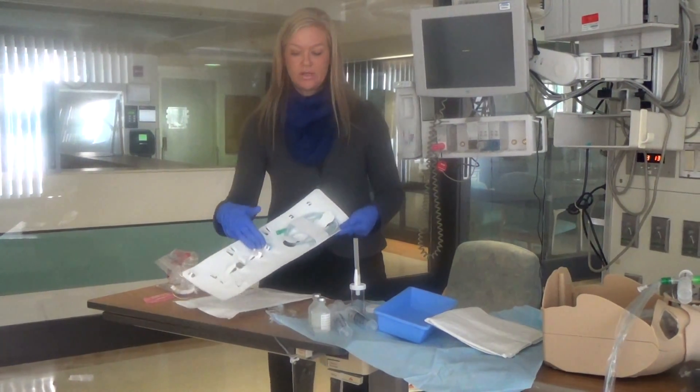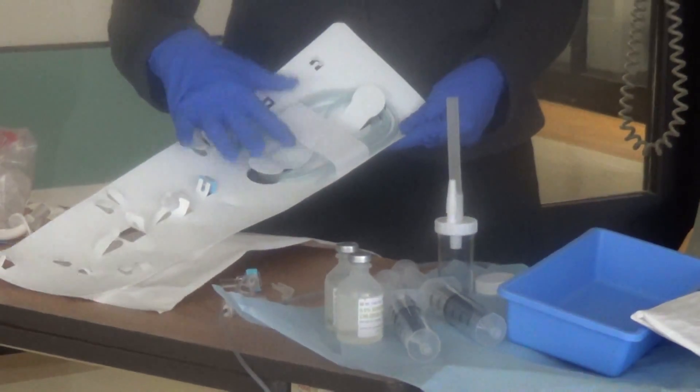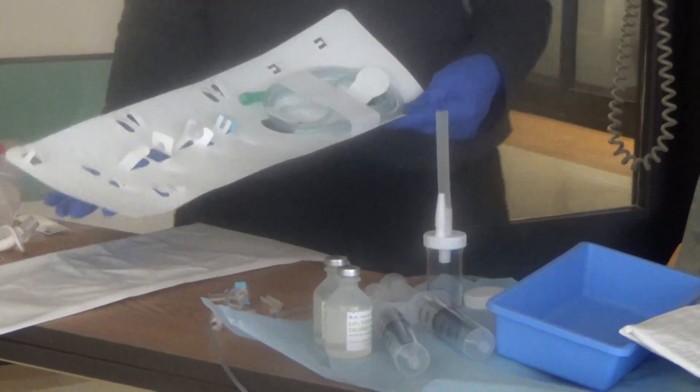The other items included in the package are not needed for this procedure at UC Davis, so you can go ahead and discard those remaining items.